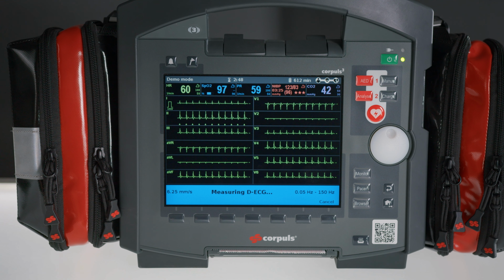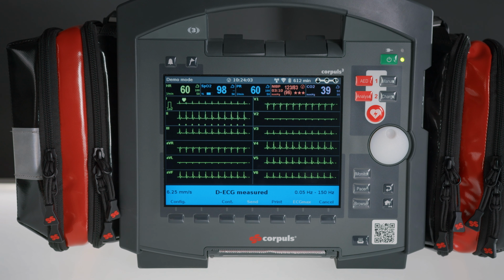We also have a small change in the auto-upload of the diagnostic ECG area. Previously, this only happened when I printed out the ECG. Now it starts automatically as soon as the ECG has been measured.